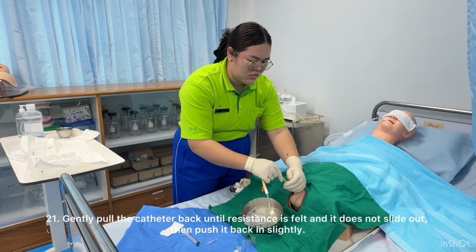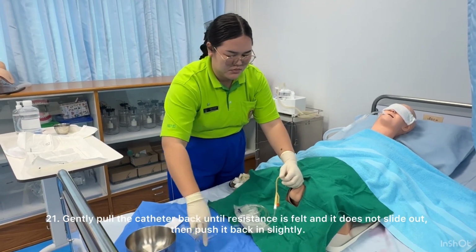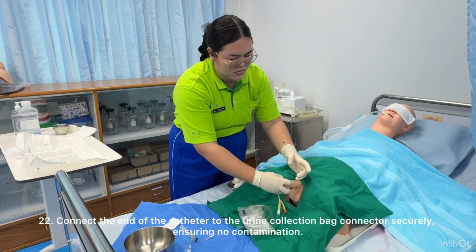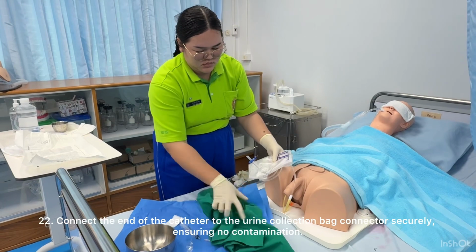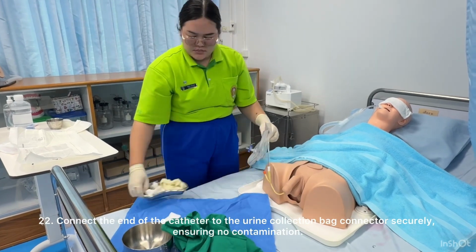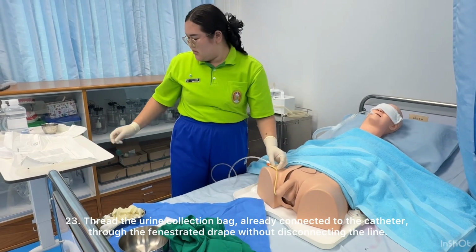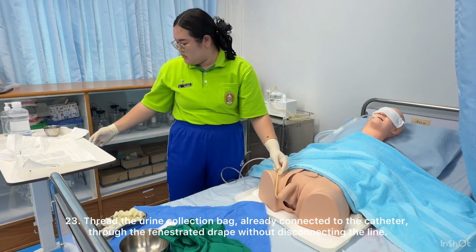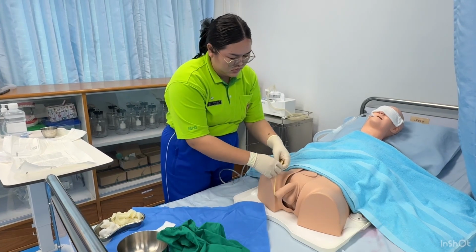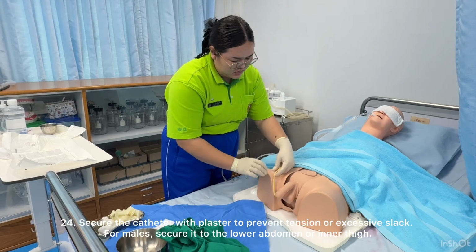21. Gently pull the catheter back until resistance is felt and it does not slide out, then push it back in slightly. 22. Connect the end of the catheter to the urine collection bag connector securely, ensuring no contamination. 23. Thread the urine collection bag, already connected to the catheter, through the fenestrated drape without disconnecting the line. 24. Secure the catheter with plaster to prevent tension or excessive slack.